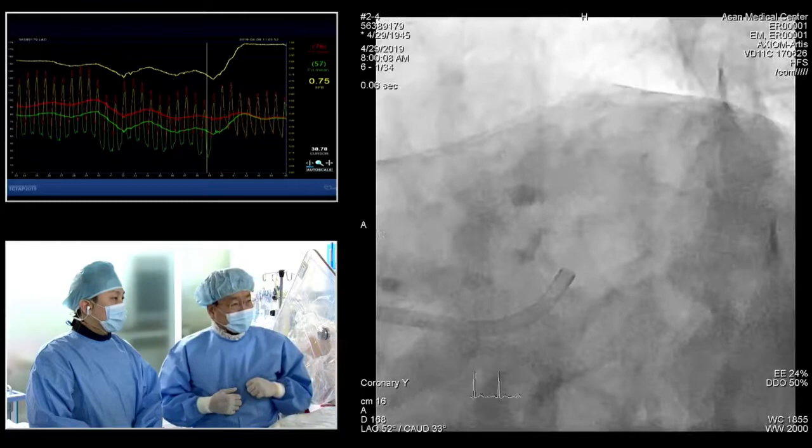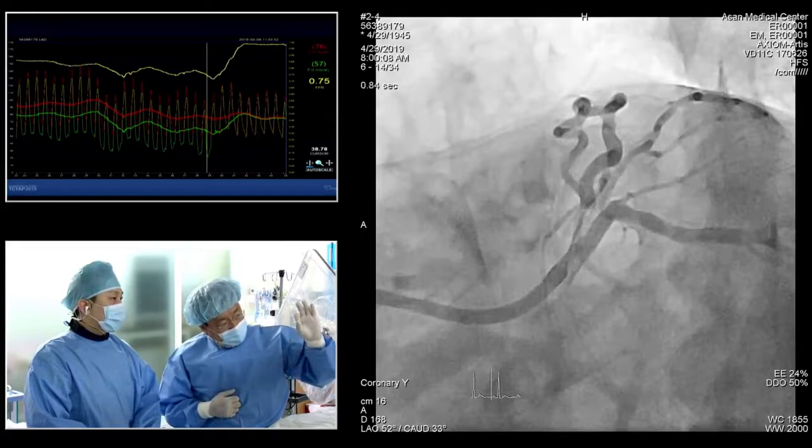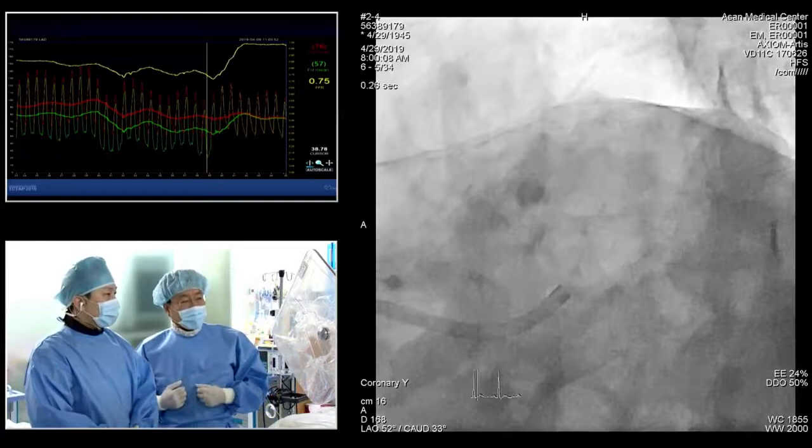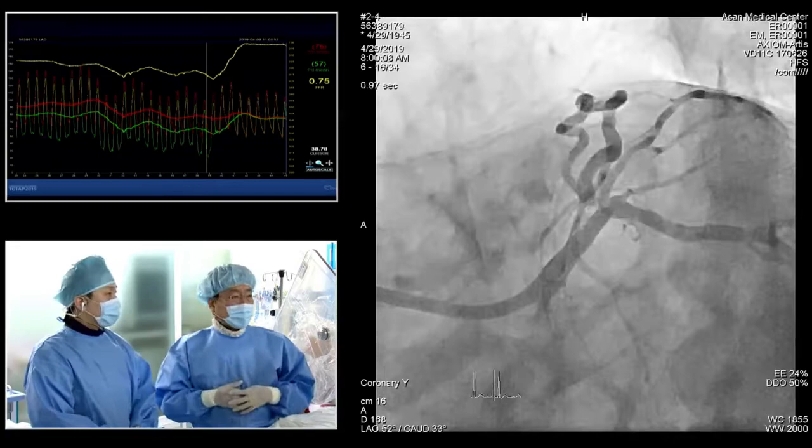All right, this is the spider view. It showed that the ostial part of the main may or may not have some disease by angiographic findings. However, we cannot discriminate that. So clearly, the patient had symptoms and a positive FFR, so we prepared this case. Let's discuss that.